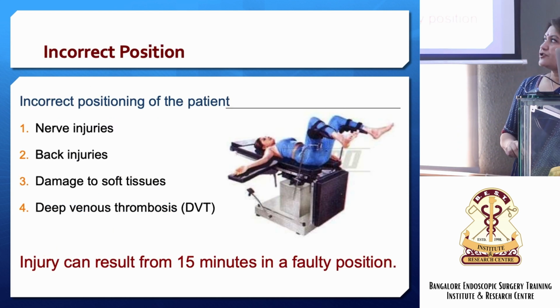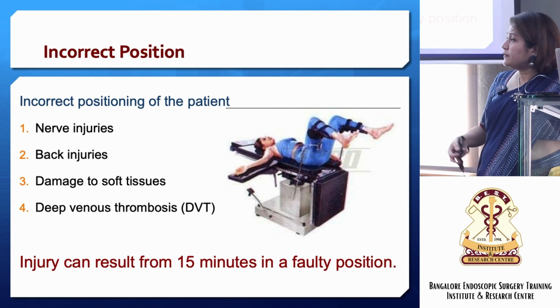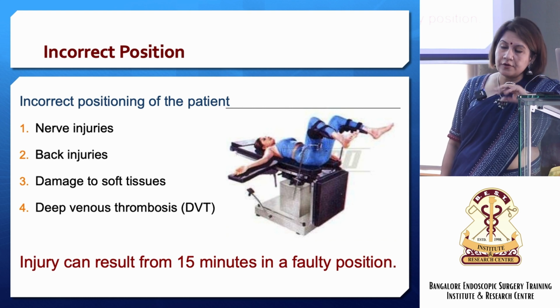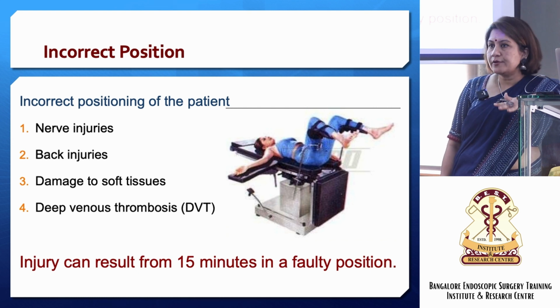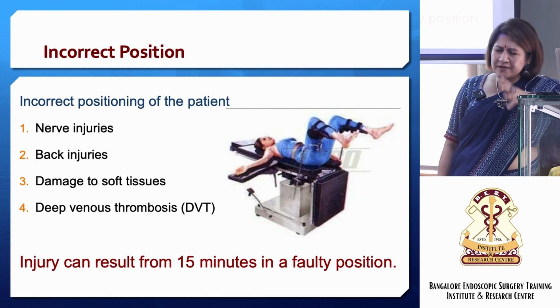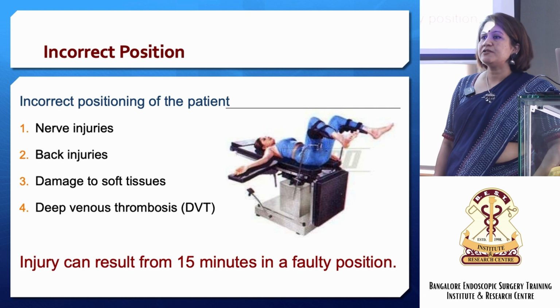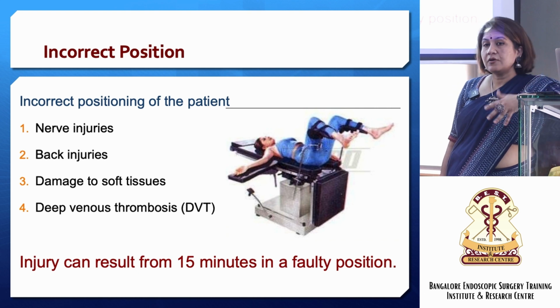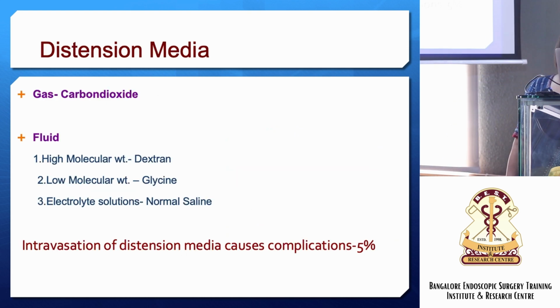Now, coming to the position, straightforward, we all know that faulty position can lead to nerve injuries. So, by practice, whether for operative hysteroscopy or for laparoscopy, I position the patient and then go for wash-up. Even though my team over a period of time has figured it out, I still prefer to make sure, because sometimes after a very straightforward TLH, the only problem will be some funny pain, and she'll eat your head for almost 7-8 weeks that it's paining. So I made it a habit that I position the patient and only then wash up. By that time, the rest of the team can arrange things.